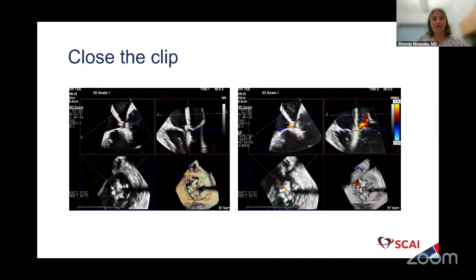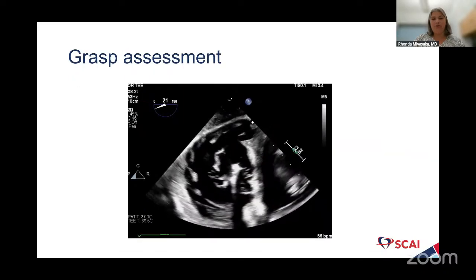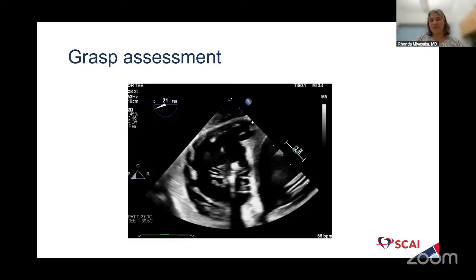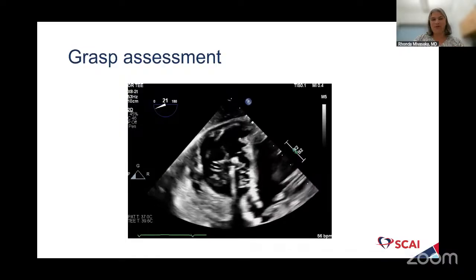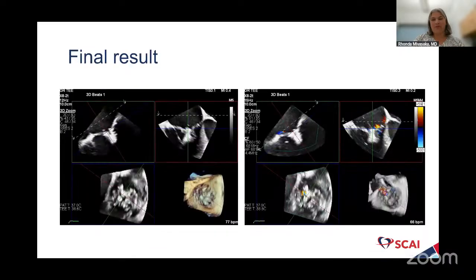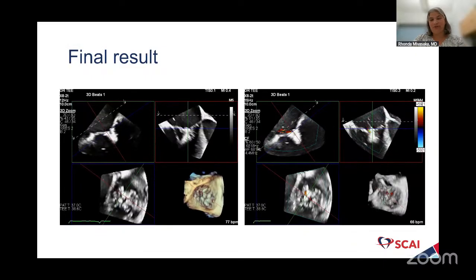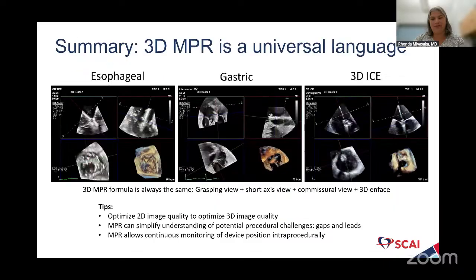We always, in addition to 3D imaging, confirm our grasp with 2D biplane imaging and gastric imaging as well. Multiple views. As much as I love 3D imaging, I'm always confirming with gastric views and esophageal views as well to make sure that we have as much information as possible. We ended up releasing this device and just ended up using just one clip for this particular patient.